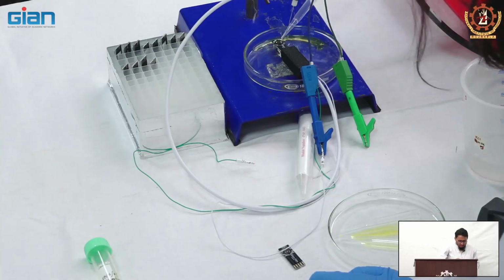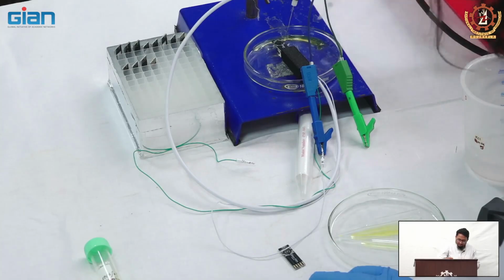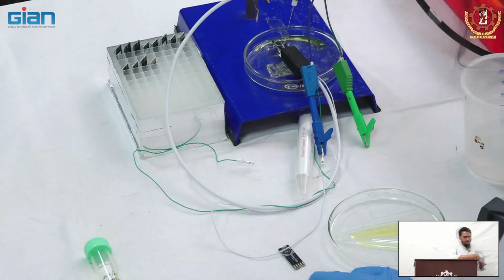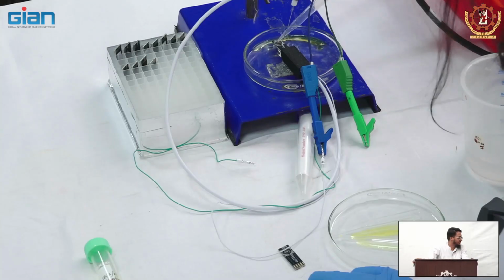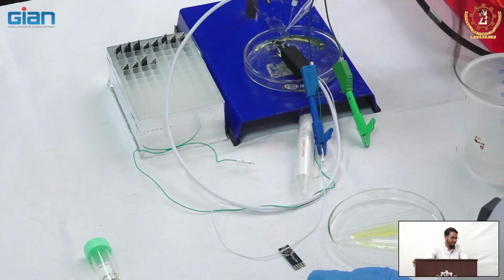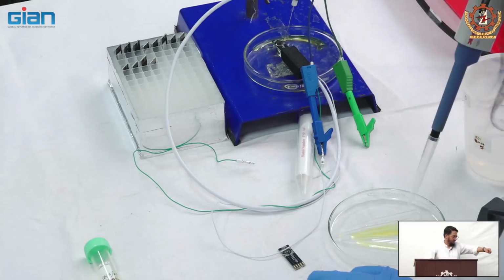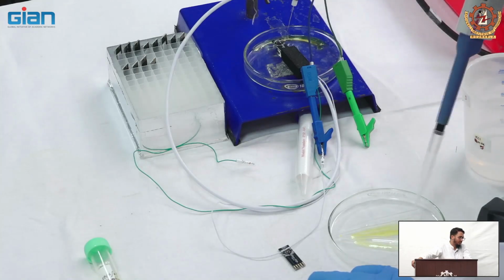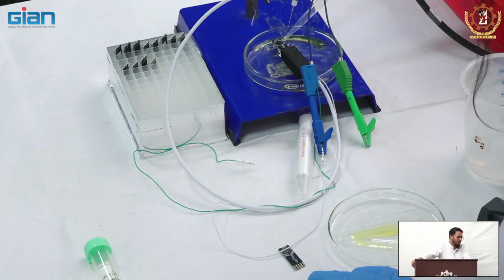So, for stabilization we will be using PBS solution and amperometry. As you can see on the screen, we will now replace the previous GOX phenols mix with the PBS solution. Again, when we are dropping the fluid on the PCB sensor, we have to make sure that there are no bubbles and the solution covers all the electrodes.